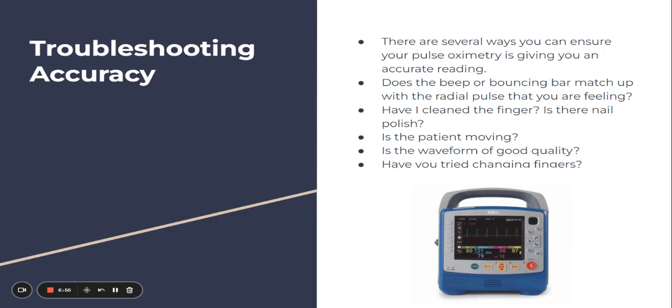It's important to know, though, just like any tool, it's not perfect. Even in the best conditions, pulse oximeters may not be 100% accurate, especially with patients with low peripheral perfusion, anemia, or under certain other environmental conditions, such as in the cold. So in all these cases, it's important to interpret the results in conjunction with other clinical information. And I'm going to repeat this because it's so important.